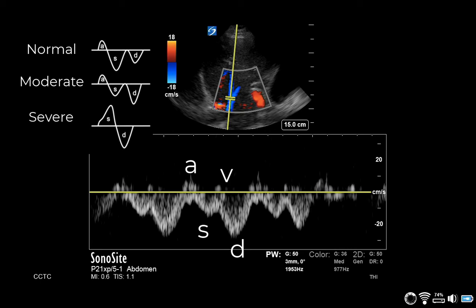In moderate congestion, the amplitude of the S wave is reduced and the amplitude of the D wave is increased. In severe congestion, the S wave becomes positive. In this example, this patient has a moderate congestion pattern.